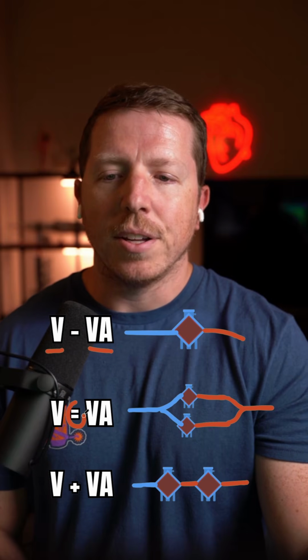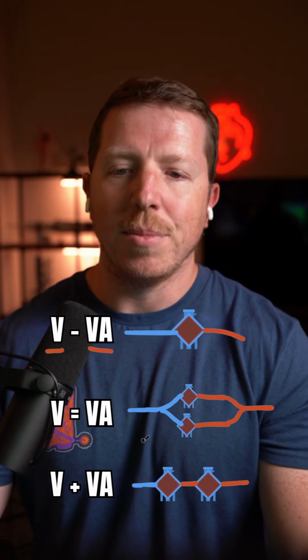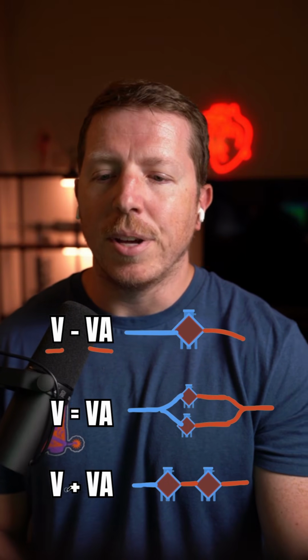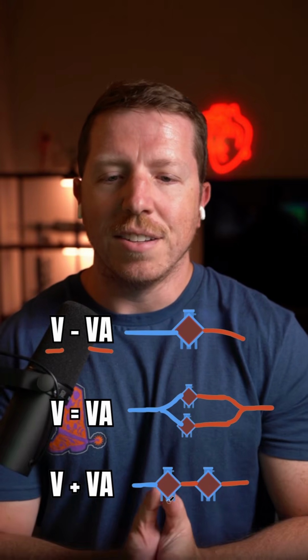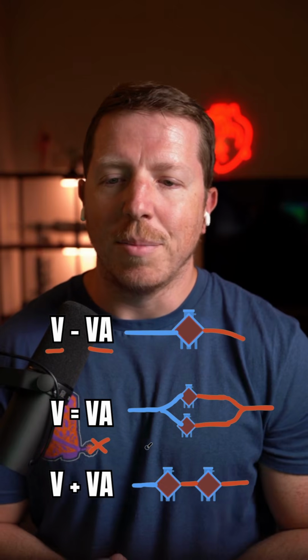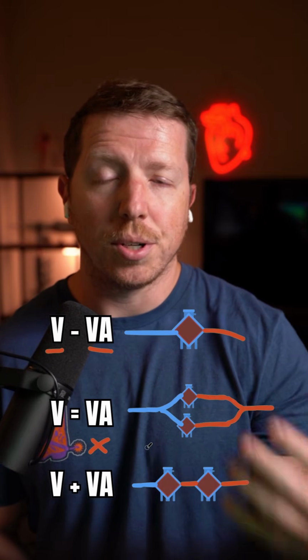Now, if we have 2 dashes or an equal sign here, that means that we have 2 oxygenators and they are parallel, as shown in this diagram here. And then if we have a plus, that means that we have 2 oxygenators in a series, meaning one right after the other. And now the fourth thing that we can have is an X, and that means that there's no oxygenator, and this is just pure circulatory support.